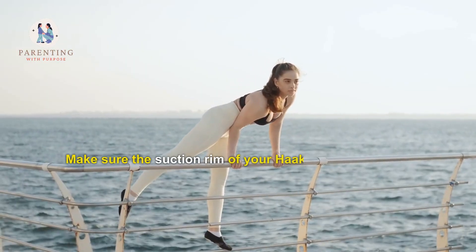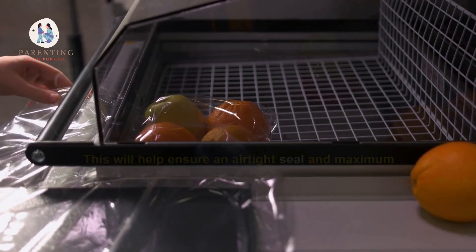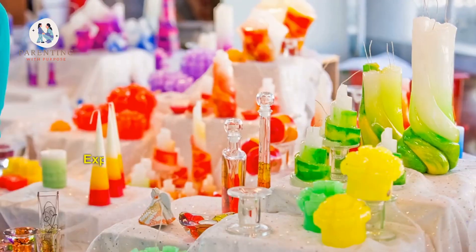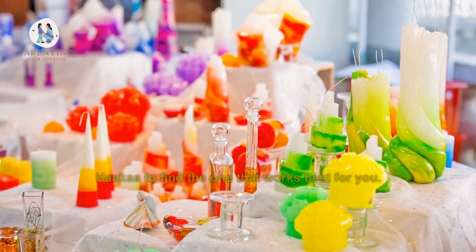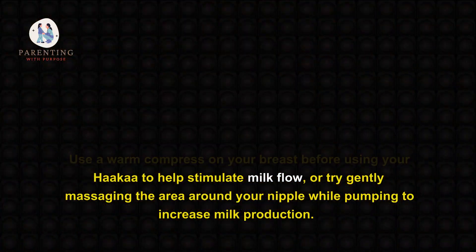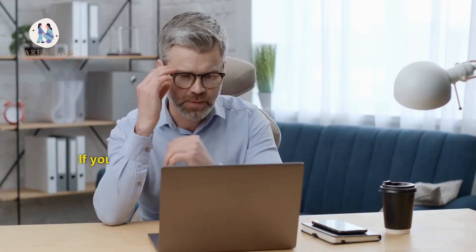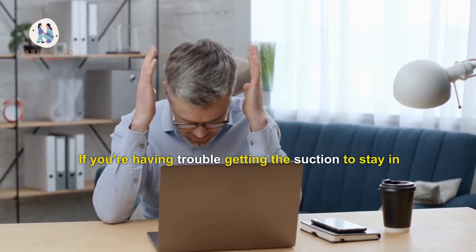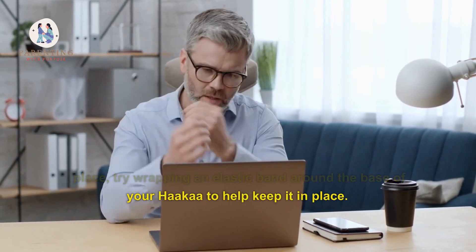Here are some tips and tricks to make breastfeeding with a Hakaa easier. First, make sure the suction rim of your Hakaa is clean before using it — this will help ensure an airtight seal and maximum suction. Second, experiment with different sizes and shapes of your Hakaa to find the one that works best for you. Third, use a warm compress on your breast before using your Hakaa to help stimulate milk flow, or try gently massaging the area around your nipple while pumping to increase milk production. Fourth, if you're having trouble getting the suction to stay in place, try wrapping an elastic band around the base of your Hakaa to help keep it in place.